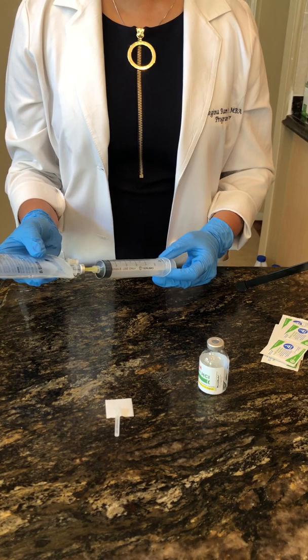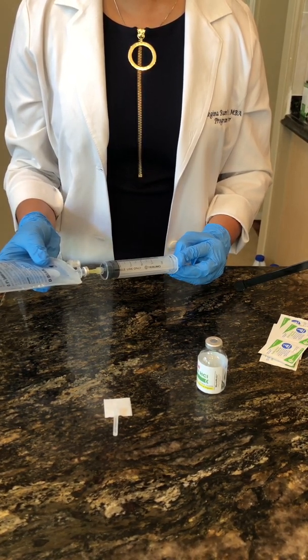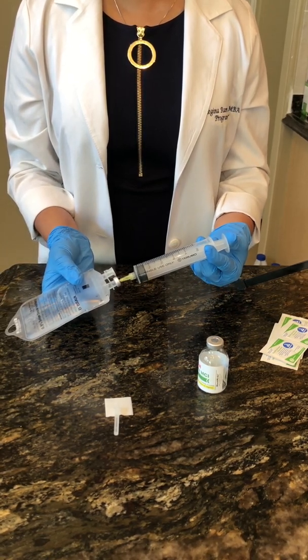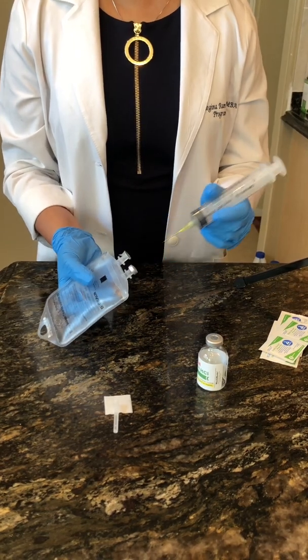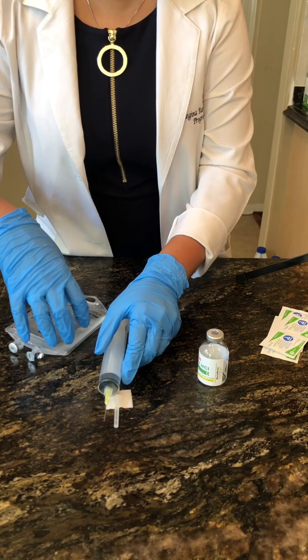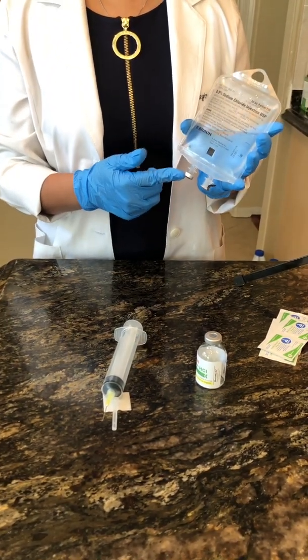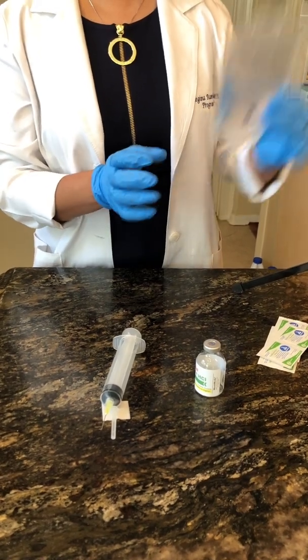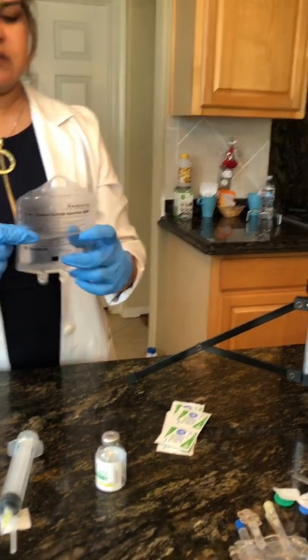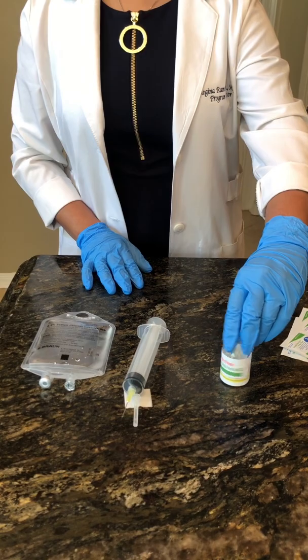Go ahead and do a little flush. Go ahead and remove. You're not going to recap — you're going to invert. Put an IVA seal. Put your label on. Inspect this for particulate matter, turbidness, sediment, and particulates. Your IV bag is ready to go. This completes the demonstration for the vancomycin powder vial.